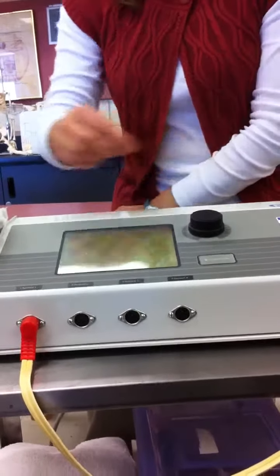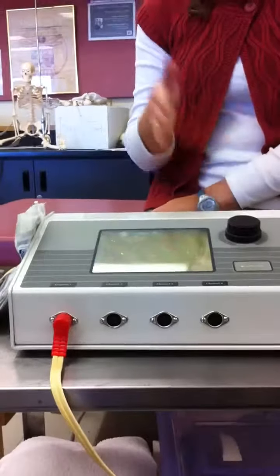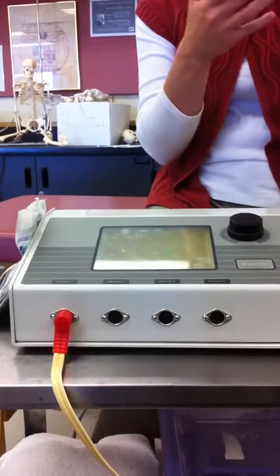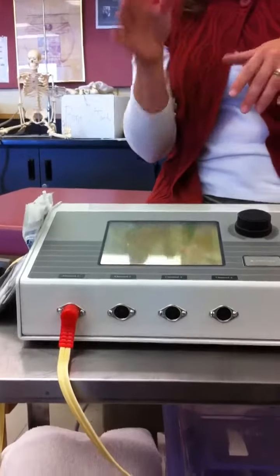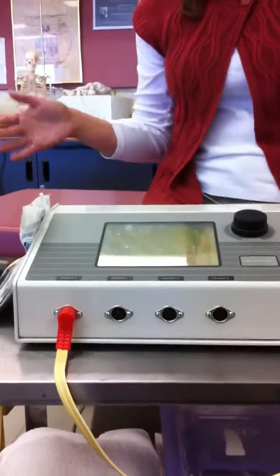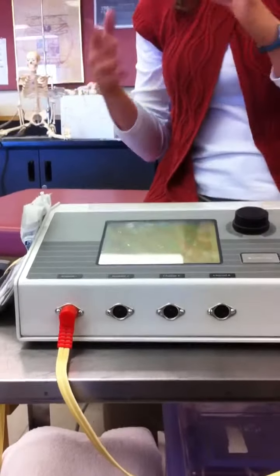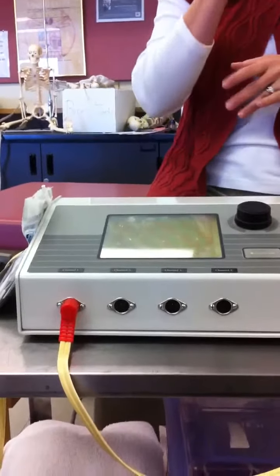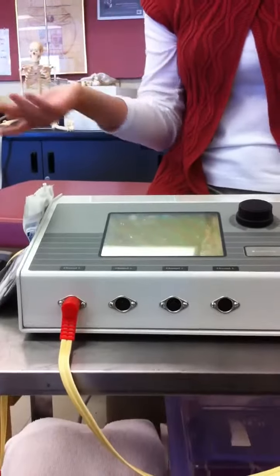Then what's going to happen is there's going to be a little question down here at the bottom. It's going to say, save this treatment for next setup or something along those lines. Please always hit no. Because if you hit yes, then there's all these other steps you have to go through to save the protocol for the next patient, and it just takes way too long. So if you hit no, it will automatically start the clock and start the treatment.